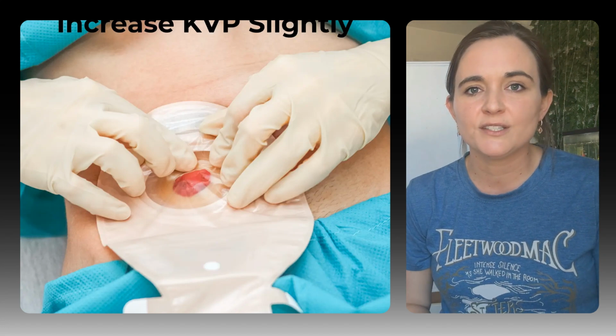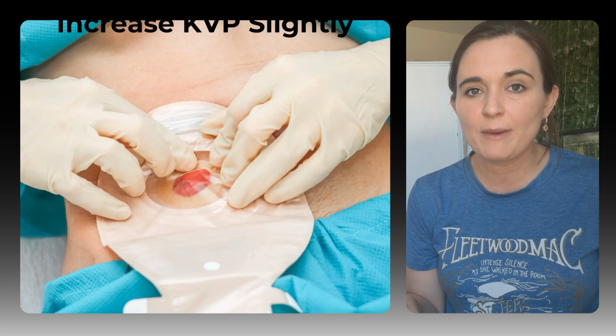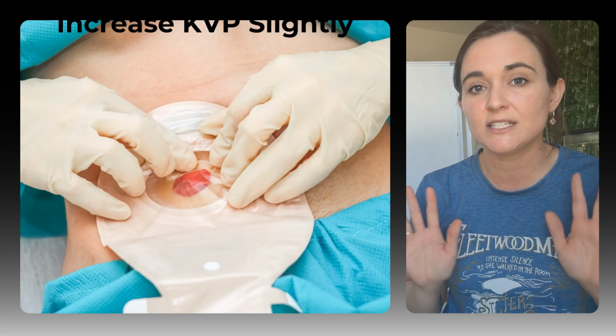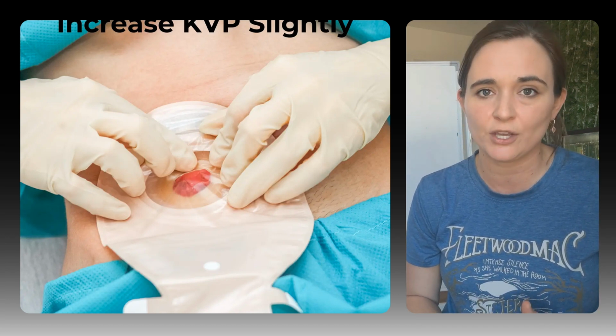What if Mrs. Garcia has a colostomy bag? Here's the ARRT approved method. Leave the bag in place, do not risk leakage, shoot through it, but increase kVp by 5 to 10 to penetrate the plastic. Annotate colostomy present in your tech notes.